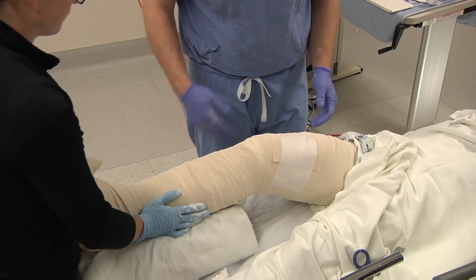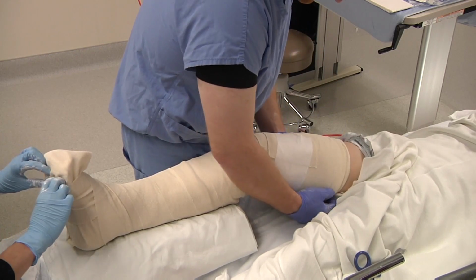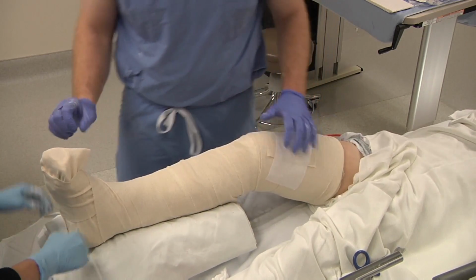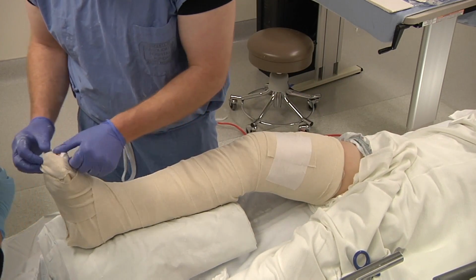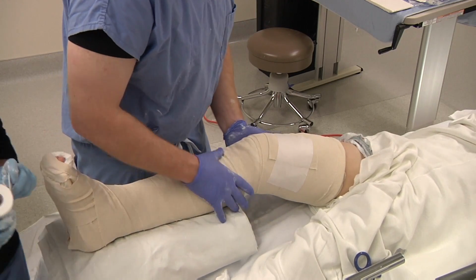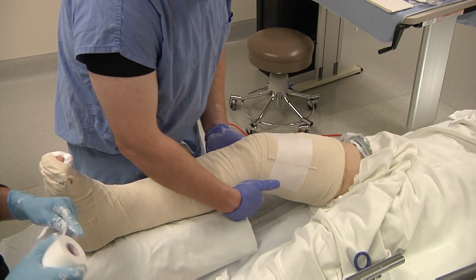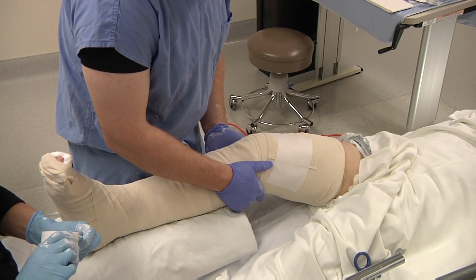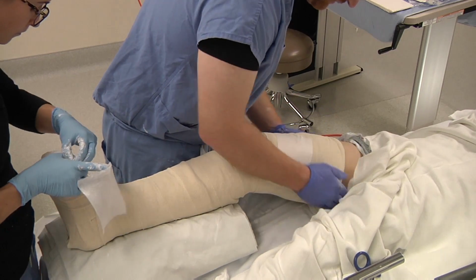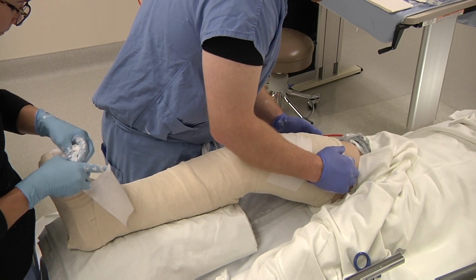Then from there, once the plaster is hard and you have an acceptable reduction, you can beautify your splints with tape. Once again, you always want to make sure at that popliteal crease, the leg shouldn't generally be bending much at this point. Well, it shouldn't be bending. So make sure there's nothing poking right into the popliteal crease. Make sure at the tops, all the way around, because that plaster can go around, that there's nothing pokey that's poking into the thigh.